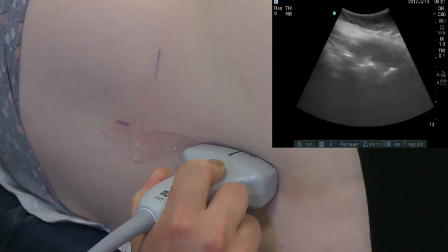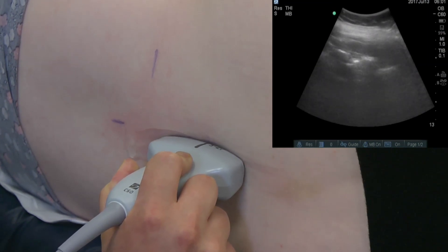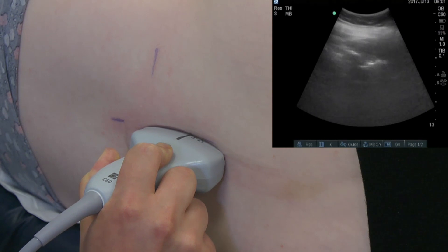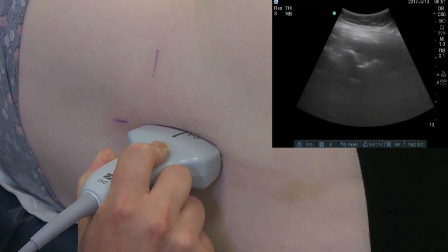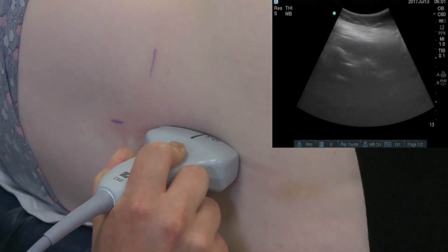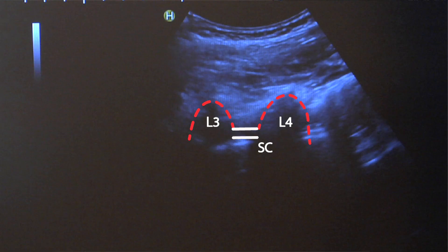Then move the probe towards the head, counting the spinous processes, which are the black vertical lines, until the midpoint of the probe is level with the L3/4 intervertebral space. Align the probe with the L3/4 spinous processes. The spinal canal can be seen between the anterior and posterior complexes deep to these.